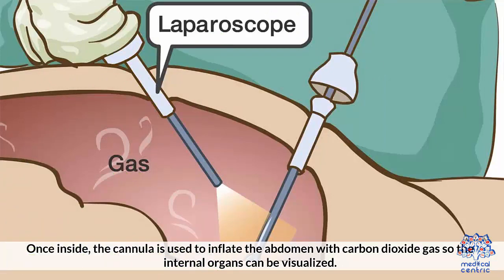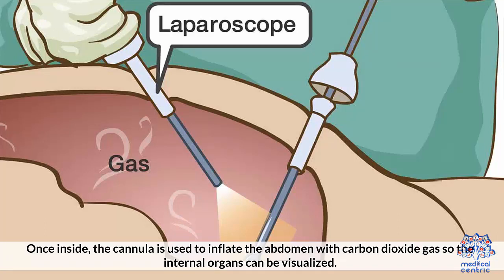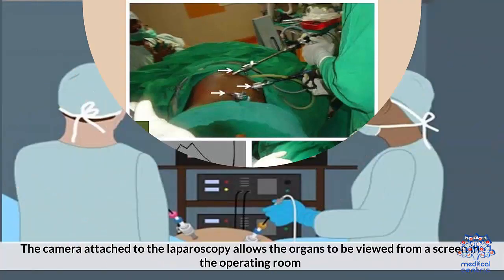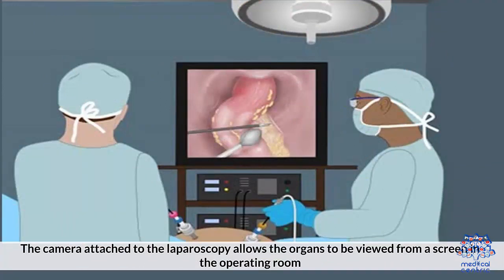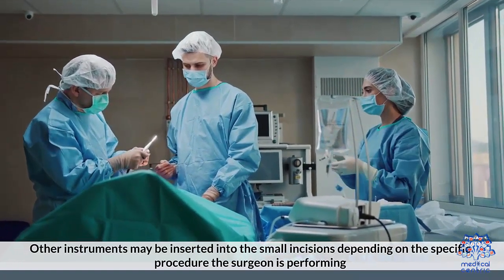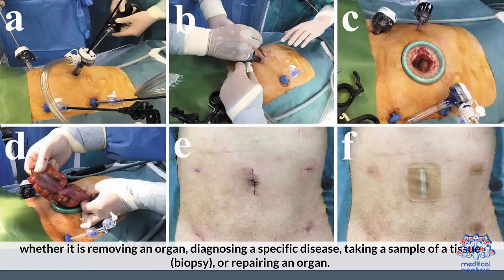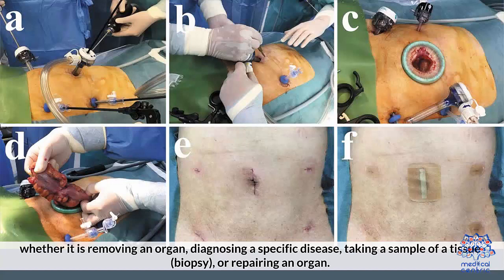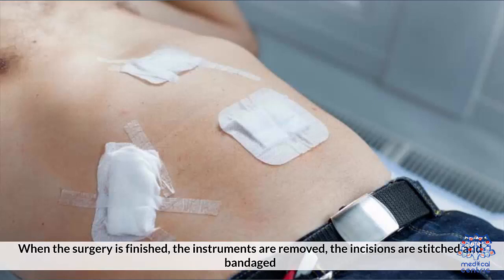Once inside, the cannula is used to inflate the abdomen with carbon dioxide gas so the internal organs can be visualized. The surgeon then inserts the laparoscope through the incision. The camera attached to the laparoscope allows the organs to be viewed from a screen in the operating room. Other instruments may be inserted into small incisions depending on the specific procedure — whether removing an organ, diagnosing a disease, taking a tissue sample (biopsy), or repairing an organ. When surgery is finished, the instruments are removed and the incisions are stitched and bandaged.